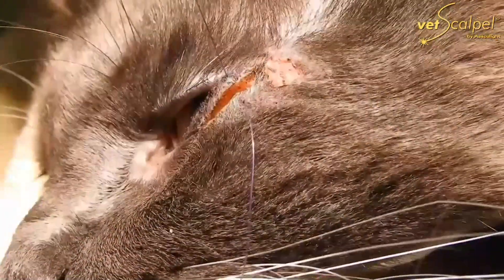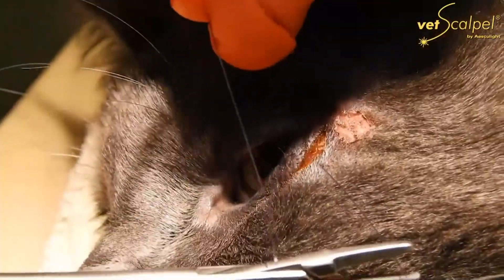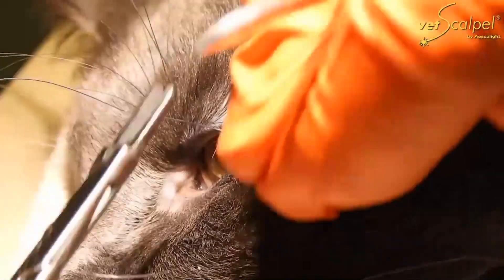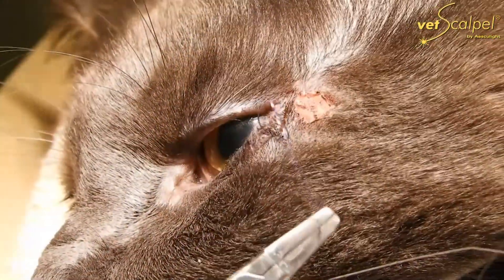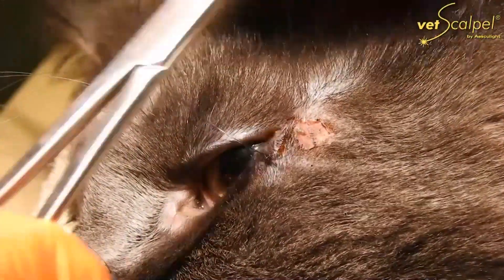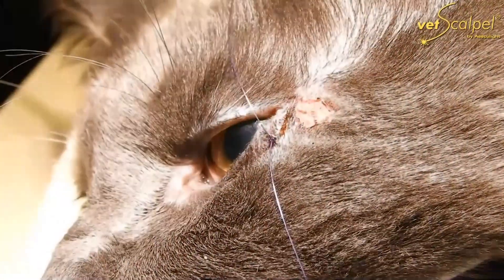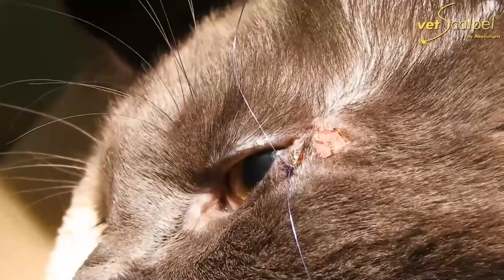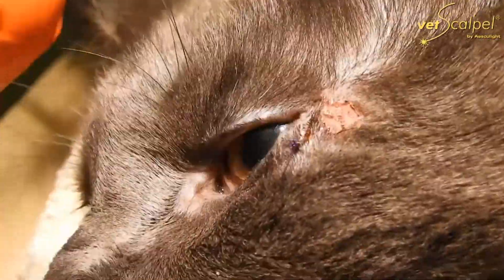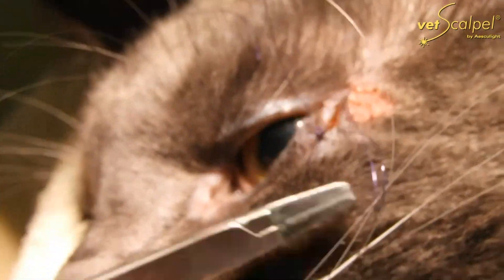The needle holders are a small type that are handier to use for ophthalmic surgery than a regular 6-inch holder. We use an Olsen-Hegar needle holder with scissors in it, but these smaller ones are easier to use for eye surgery. The middle suture is placed first — we do this as interrupted sutures. Don't pull it too tight; then you can check your incision to make sure enough tissue was removed to correct the problem. His lid looks to be in perfect position, so we'll speed this up for the final sutures.